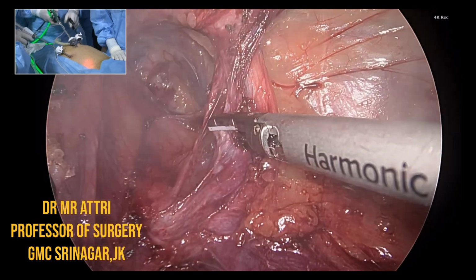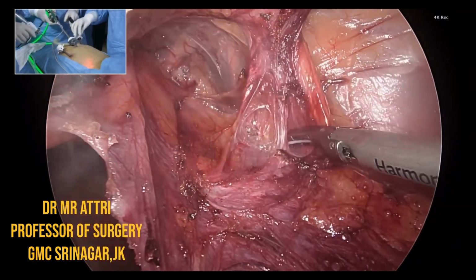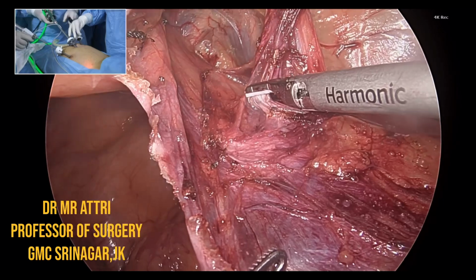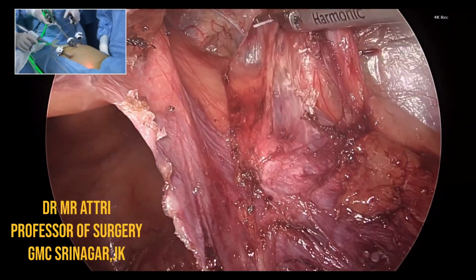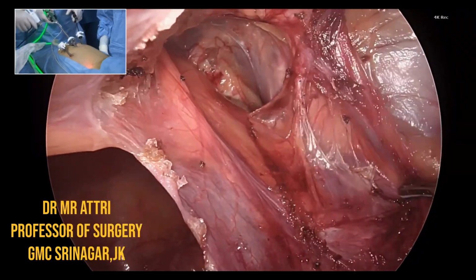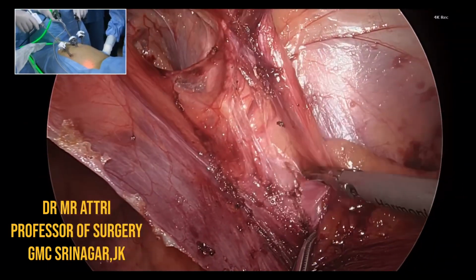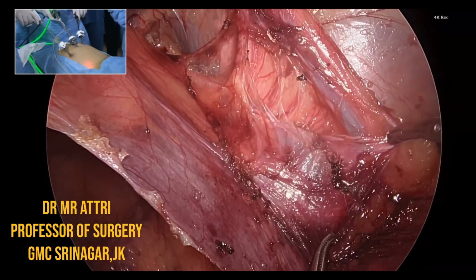So, on one side, you can see that there is the pubic bone, and on the other side, there is the costal margin. So, it is just between the costal margin and the pubic bone, and this space is a very limited space. Can you see that? Now, once you have a boundary wall hernia, these are more challenging, whether they are near the pubic bone, or near the iliac spine, or near the costal margin. And we have a very narrow space here.